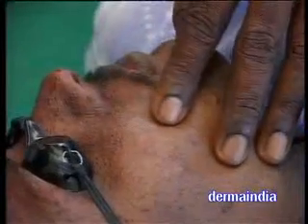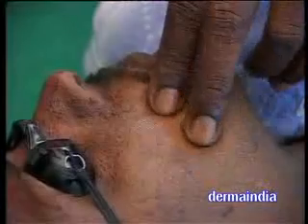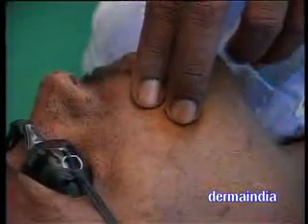If I choose square in random mode, the shape will keep shifting. In normal mode, only the same size that I choose will be repeated. Can you see the microscopic minute dots with normal skin in between? You will find a lot of normal skin in between. As much as the involved skin is there, there will be an equal amount of normal skin, so the normal skin will allow the healing process to be faster.